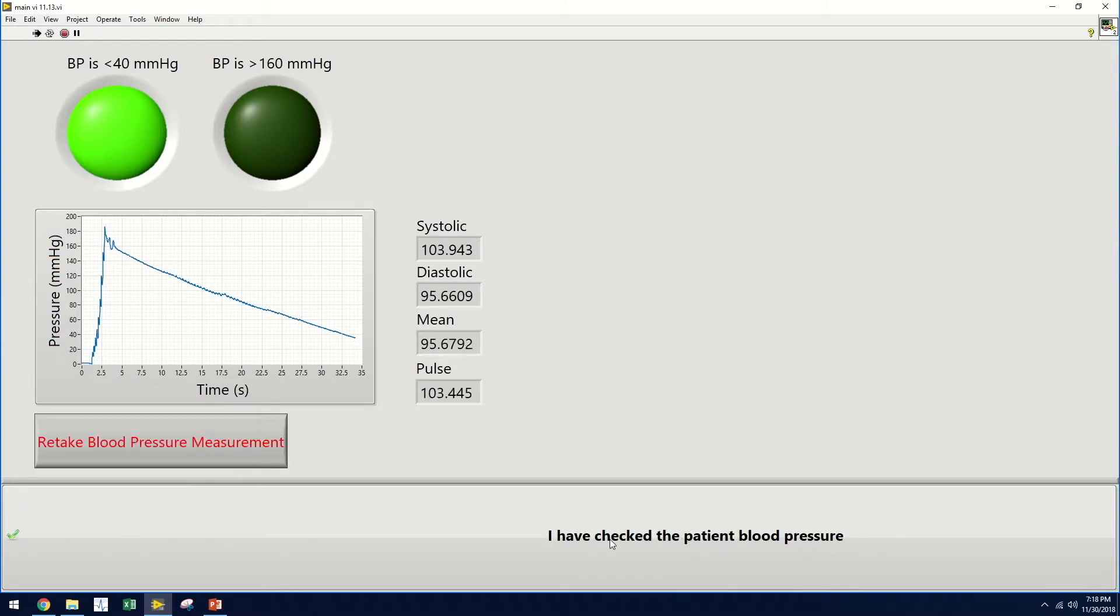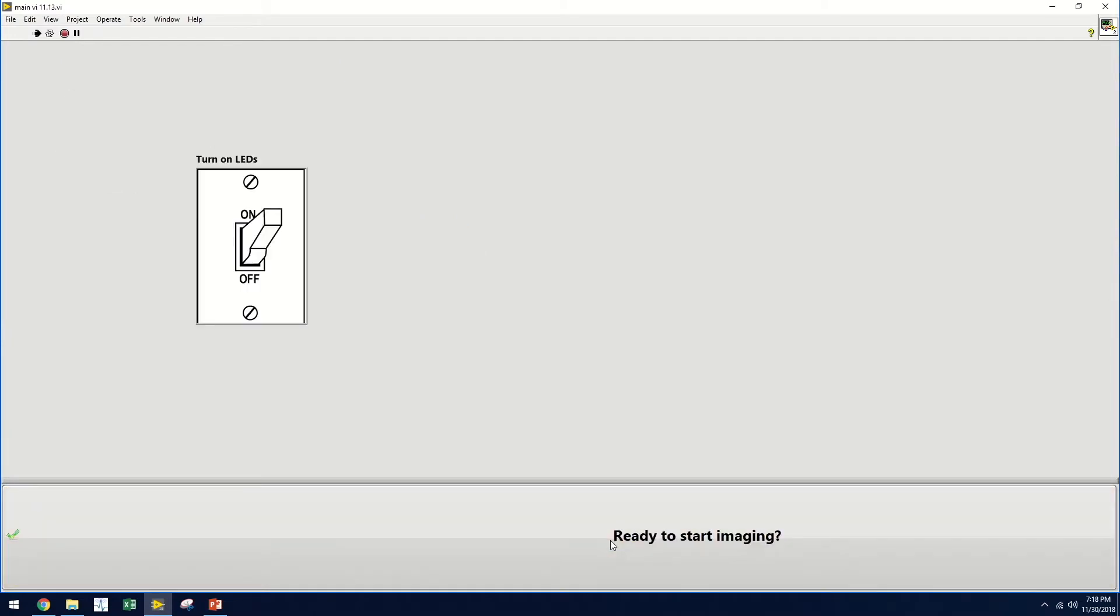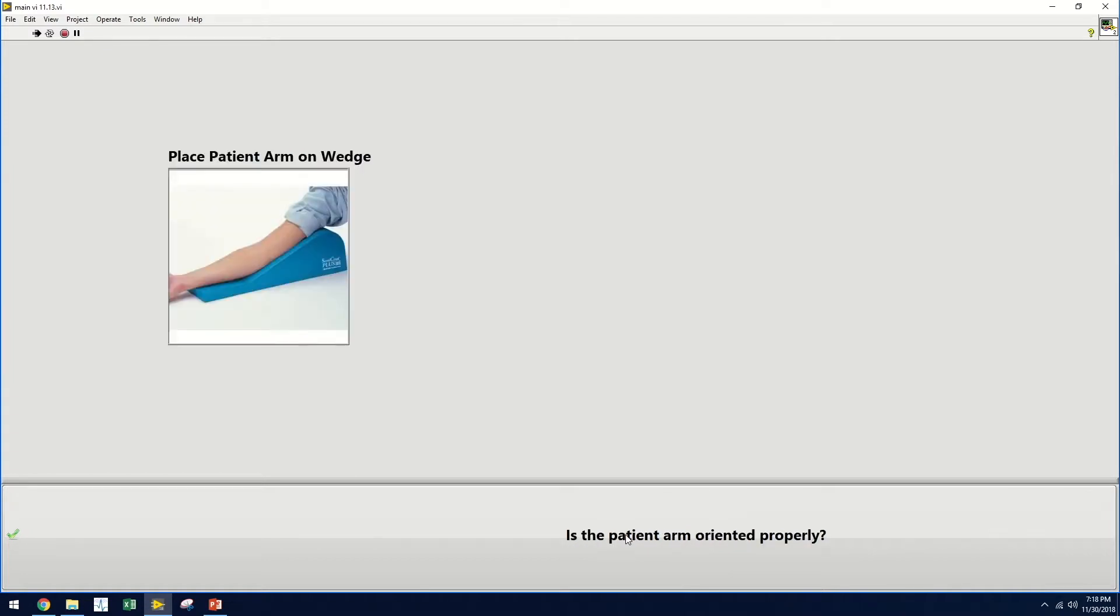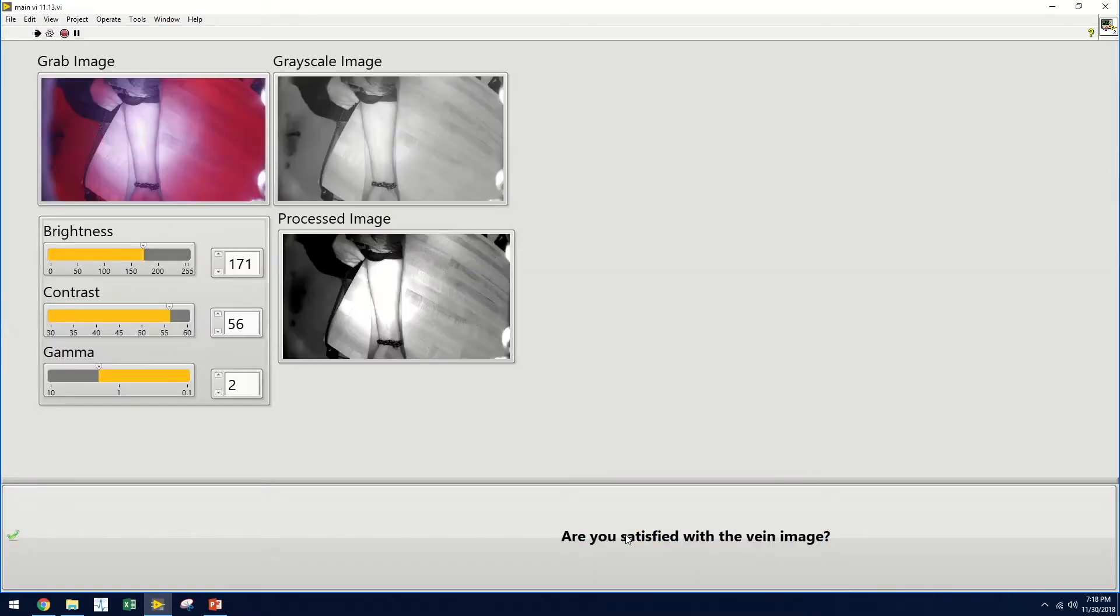If the user is satisfied with this data, they can select that they have checked the patient's blood pressure. They are then prompted to turn on the LEDs associated with the device, and to position the patient arm correctly. Now they can begin imaging.